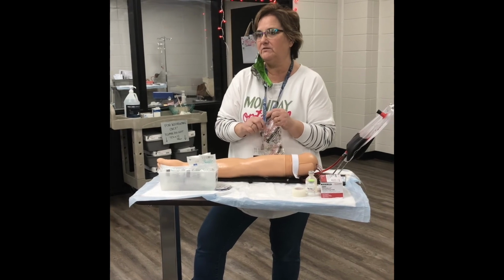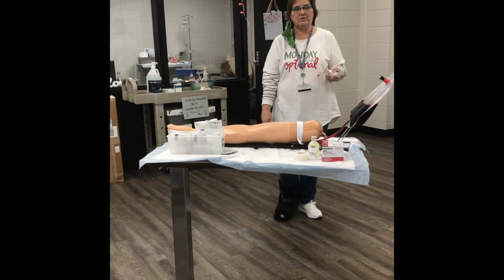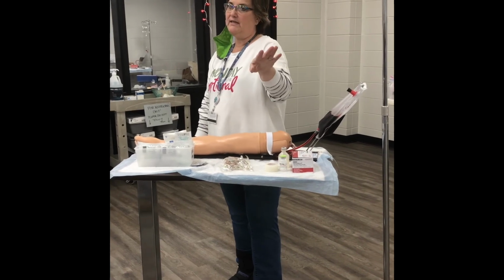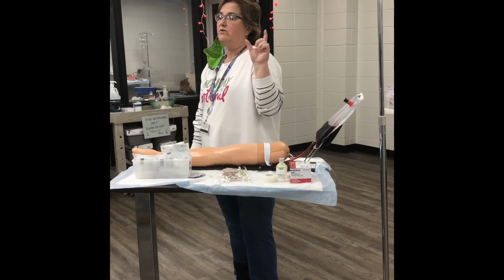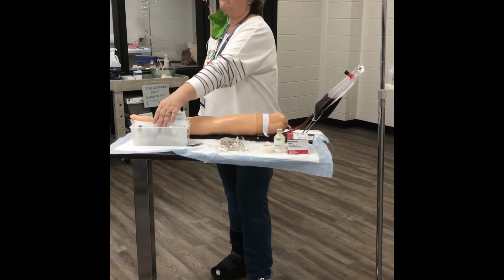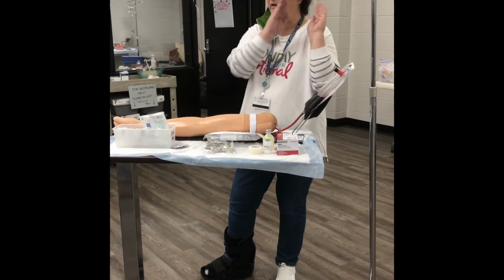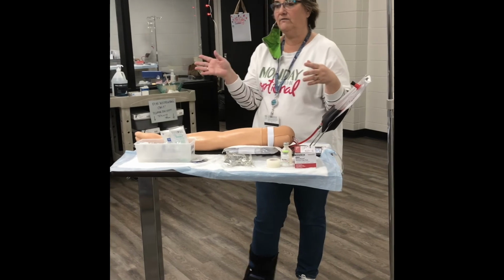But do tell them you would verify the solution 3 times. Something similar to normal saline at 100 milliliters per hour. All right, and you're going to have to take that and convert it to drops per minute. That's going to be your drug problem. So you go to the milliliters per hour and you multiply that times your drop factor, and where's that? On your tubing. Okay, and divided by 60 minutes in an hour. That's all you got to remember. Milliliters per hour times the drop factor over 60. It's going to give you drops per minute.